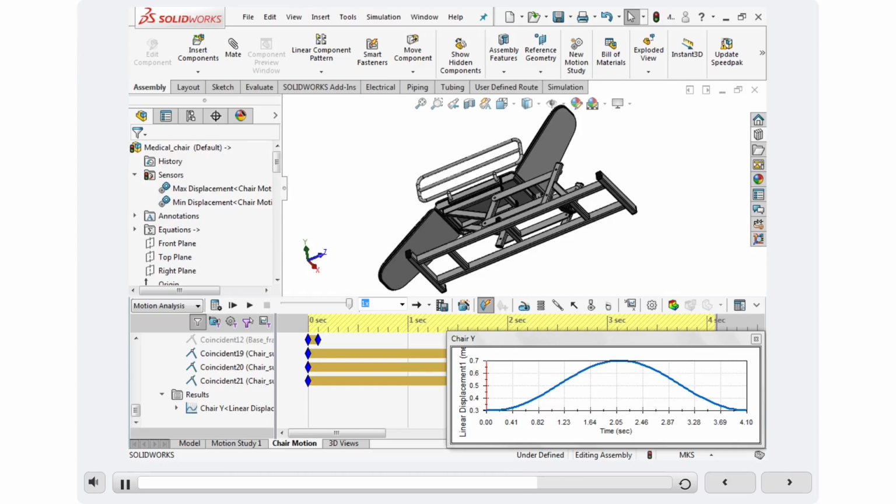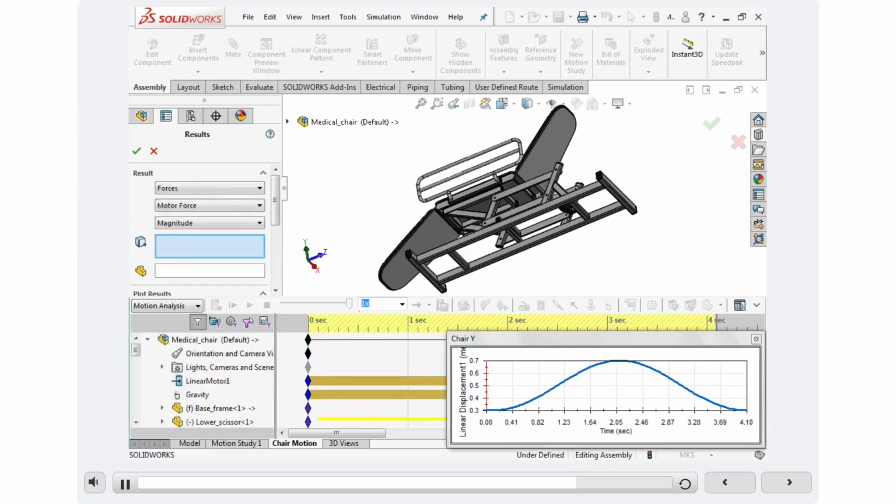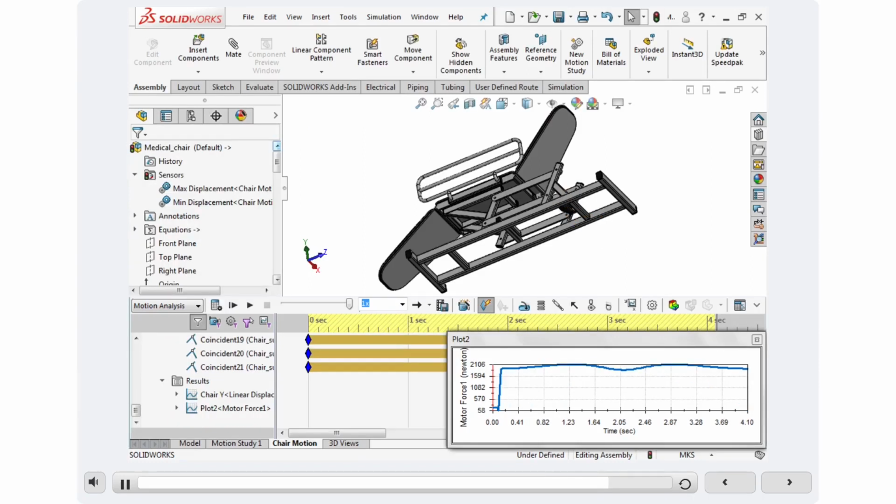We will start by plotting the force required to lift the chair. Click Results and Plots. Under Result, select Forces as the category, Motor Force as the subcategory, and Magnitude as the result component. Under Select Translational Motor Object to create Result, click Linear Motor 1 from the Motion Manager tree. Click OK. Next, we will rename the plot as Motor Force Plot. The required force is a bit over 2,100 newtons.